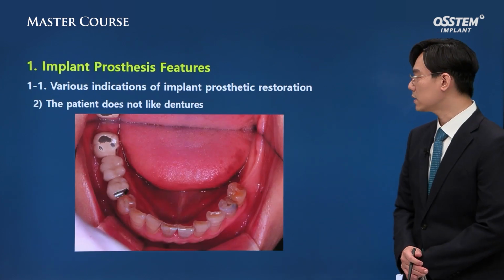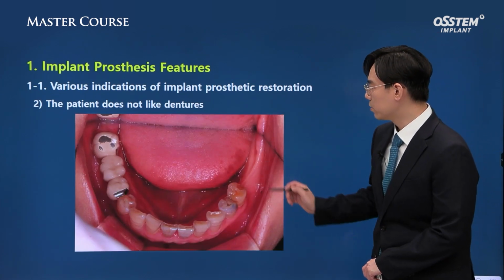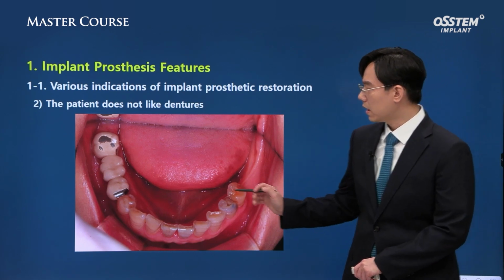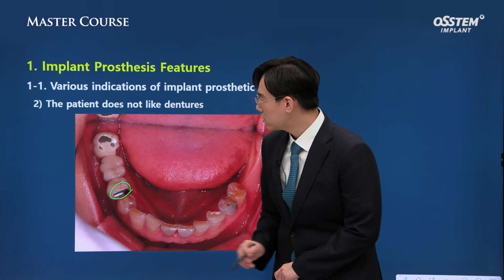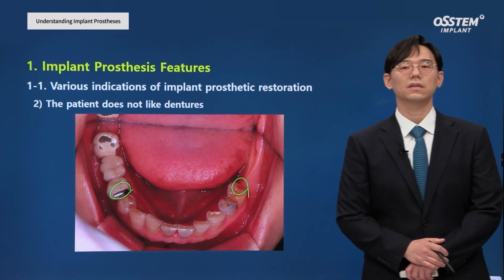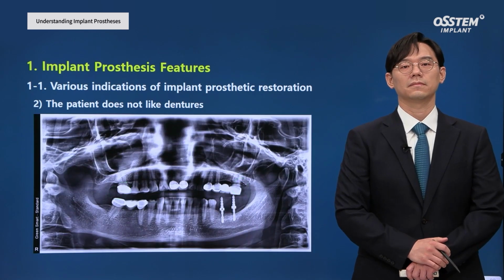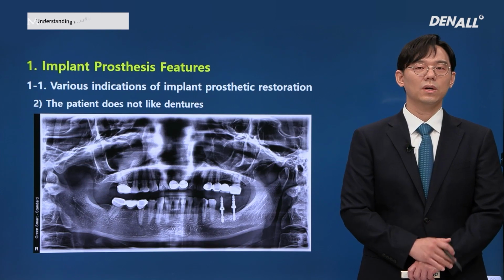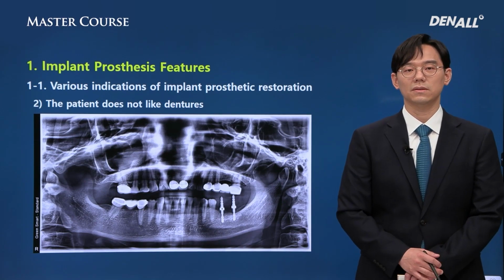As you can see, there are teeth missing in the lower left and in the lower right. There's a channel to set the RPD. In number 35, there is a rest. Initial drilling is done in order to check position and path. Guide pin was placed and panoramic image was taken.